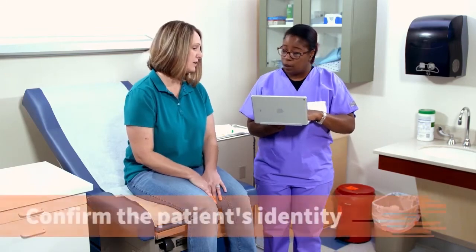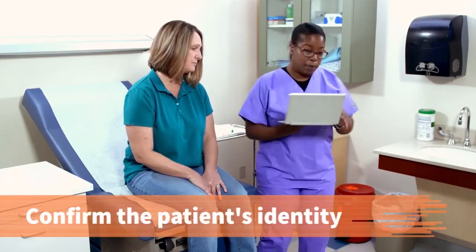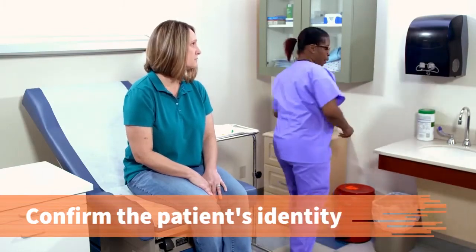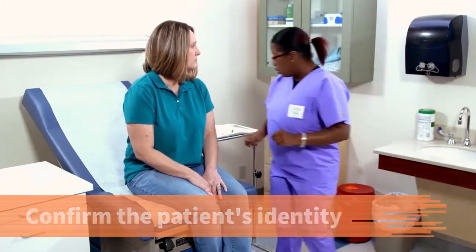I want to verify a few things with you. Okay. Can you give me your name and your date of birth? It's Tina Lakin, 4/21. Verify the patient's identity with her full name and date of birth. Make sure the patient's information matches the order and the record.